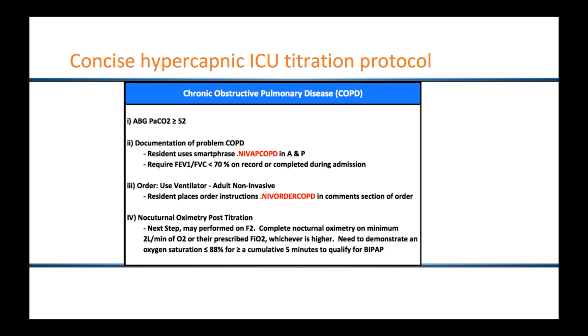Respiratory therapy has agreed to do bedside spirometry when the patient is considered clinically stable, and the order cannot be a stat order.